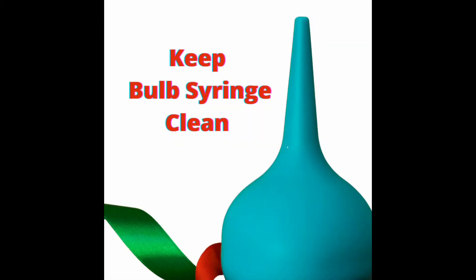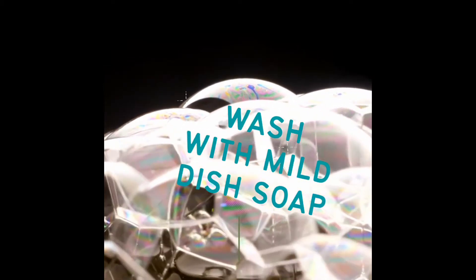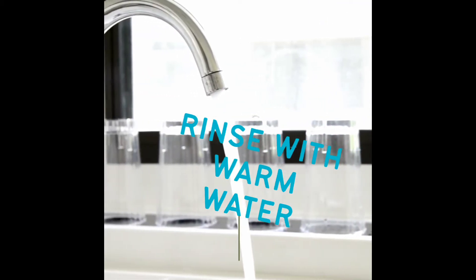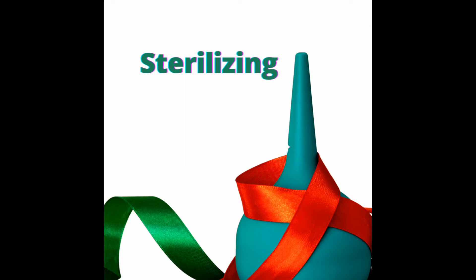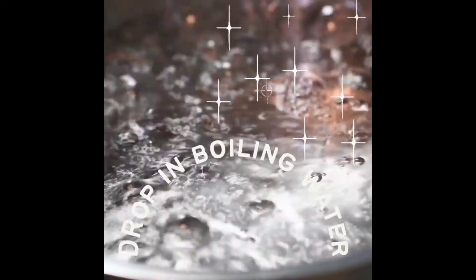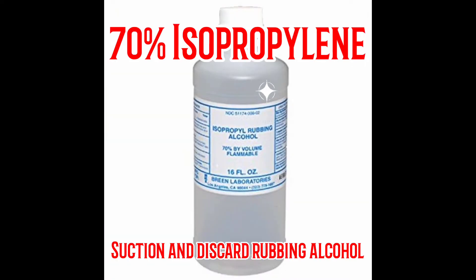Keep the bulb syringe clean: wash with mild dish soap and rinse with warm water. For sterilizing, suction and expel boiling water, or drop it in boiling water. To disinfect, use 70% isopropyl alcohol — suction and discard the rubbing alcohol.